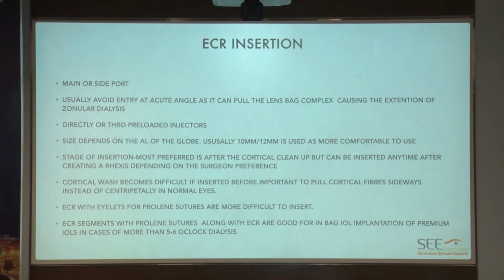The stage of insertion of ECR. In my initial days, I always preferred using it post-hydrodissection because I was scared about lens drop. But more recently, I usually prefer it after the nucleus expression, before the cortex aspiration.